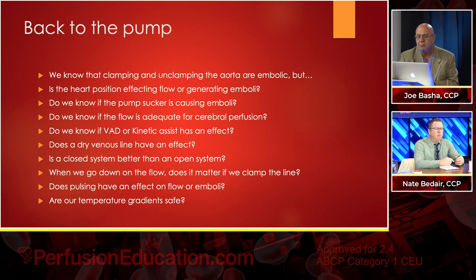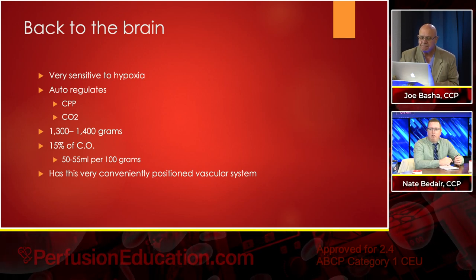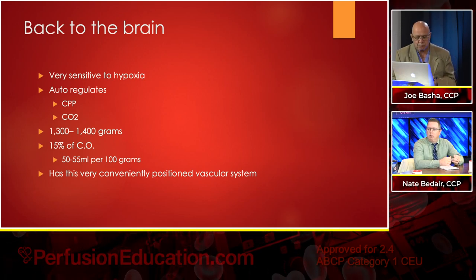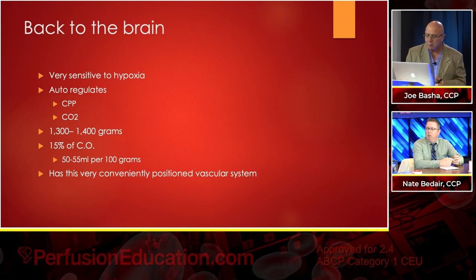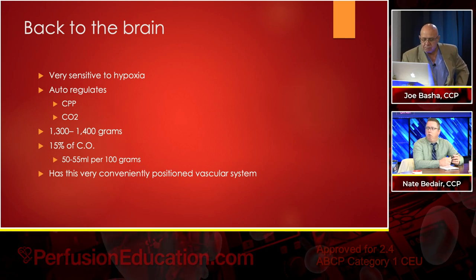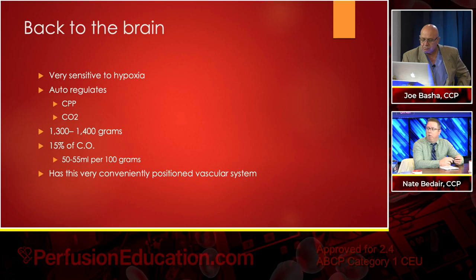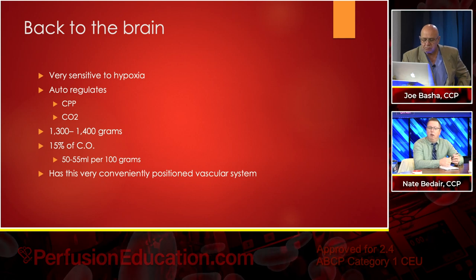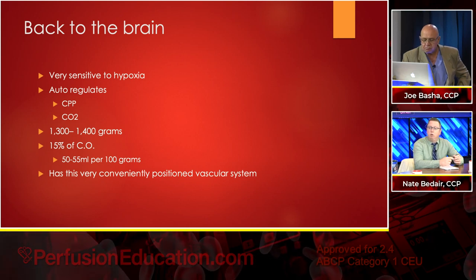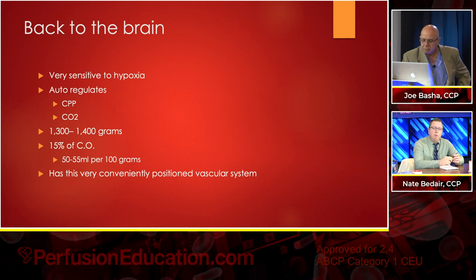That's a big one. I don't know about stroke-wise, but I've had that thought before, because a lot of times our surgeons will drift and then they say rewarm. Well, it's a big patient. It's a 115-kilo patient, and he's got two proximals. To rewarm, I've got to scramble. I've got to be cranked wide open, and we're starting at 30 degrees. And these rooms are cold, in some cases really cold. So it takes quite a bit to rewarm that patient.